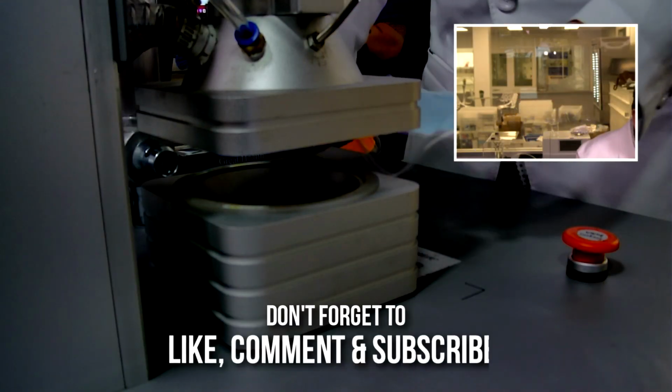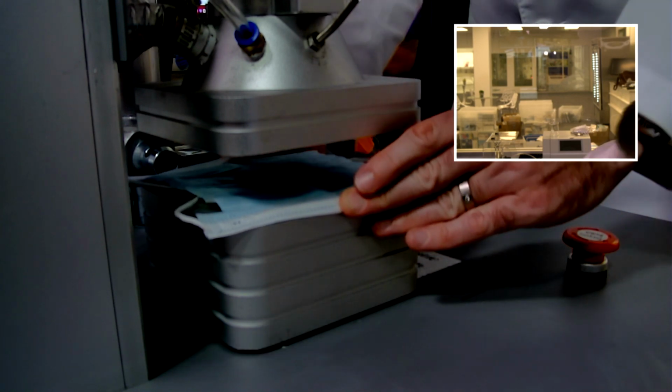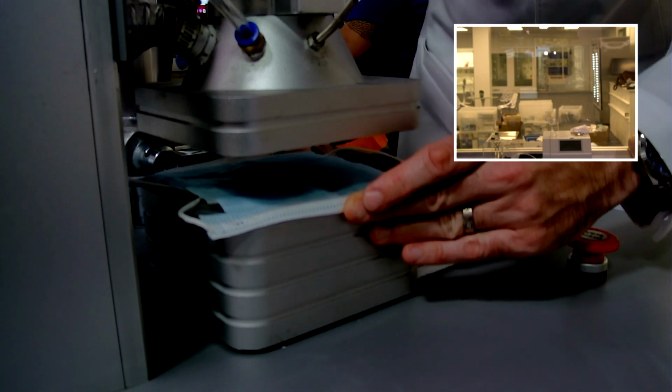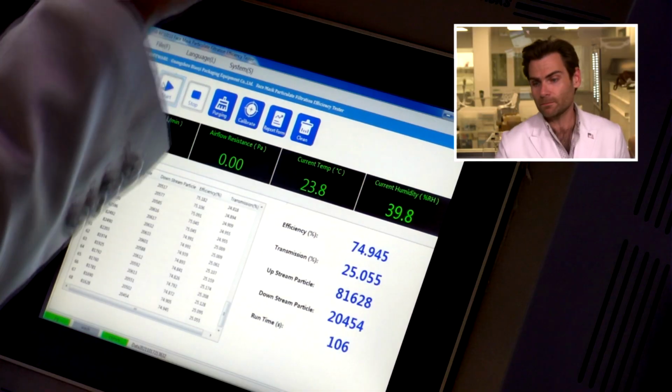We haven't tested this before, have we? Nope. Okay. Thank God. Oh, this one is a tight one. This is going to get me. Pinch, pinch, pinch, pinch. Get him, get him.